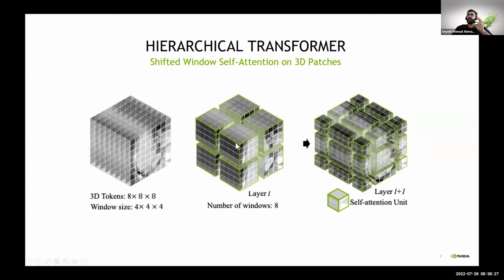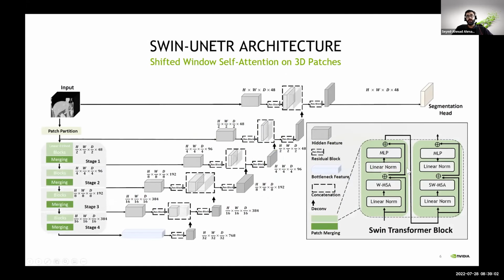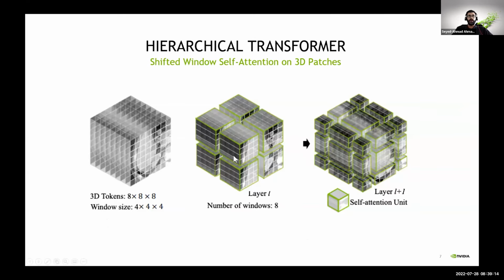In doing this, we basically reduce the quadratic complexity to a linear complexity, because we don't have every-to-every attention, but basically the receptive field of this window, the patches, is limited. The only problem is that if we compute multi-headed self-attention within a window only, then we lack the spatial context of, for example, this patch to the patch over here. So there's no cross-communication between these windows. And for this, every SWIN transformer block has 2 multi-headed self-attention parts. So basically these blocks always come in pairs of 2. You can have 2 or 4 or 6, but you cannot have 1 only, because the 1 basically helps us maintain a linear complexity, but we also want the cross or long-range spatial context.